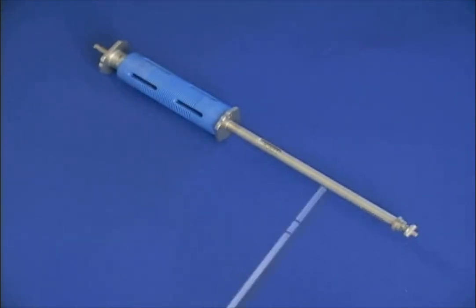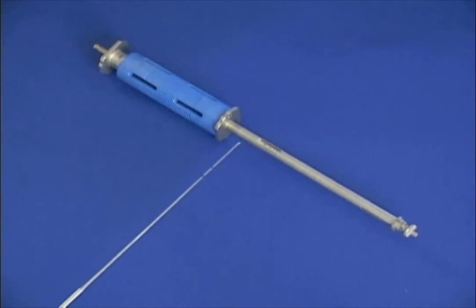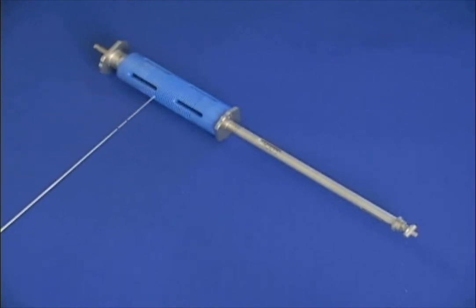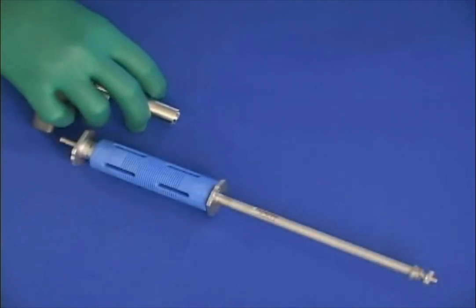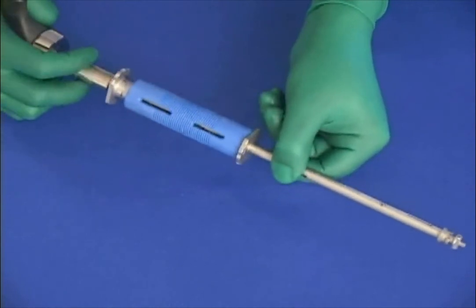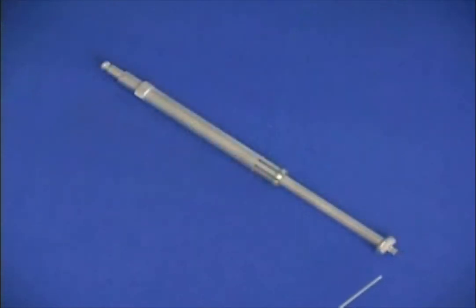The distal tip of the standard screwdriver is first loaded into the head of the screw, after which the mating surface of the driver is rotated into the screw head to lock the screw to the driver. Locking is confirmed via the window in the instrument shaft. Rotation of the mating surface into and out of the screw head is accomplished via the silver knobs located nearest the screwdriver handle. The screwdriver is loaded into and released from the ratcheting T-handle by pulling back on the Hudson fitting of the T-handle. The quick driver minimizes steps during loading and unloading of the screw and is offered as an alternative to the standard driver.